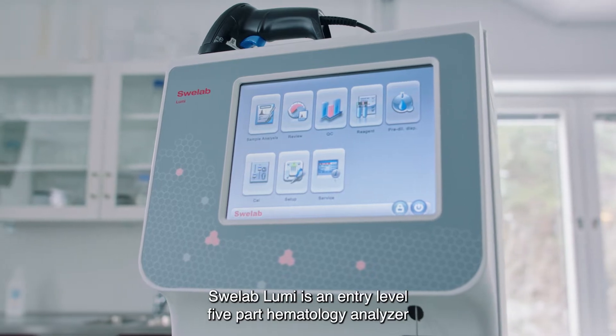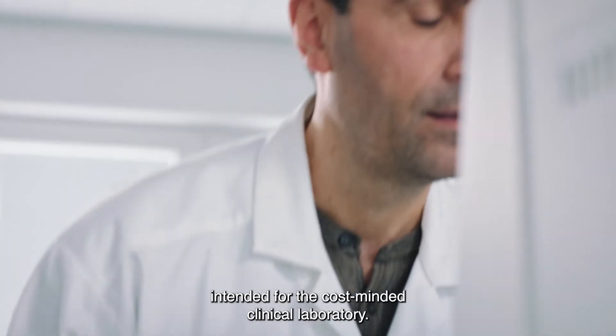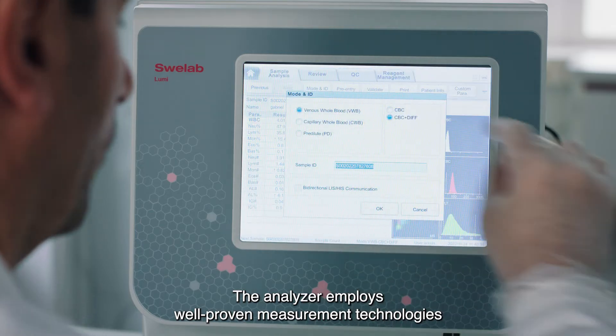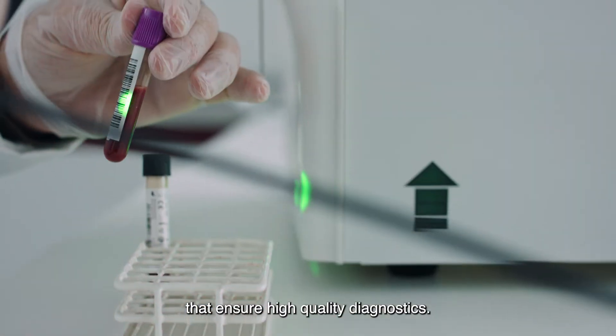SWE Lab Lumi is an entry-level, five-part hematology analyzer intended for the cost-minded clinical laboratory. The analyzer employs well-proven measurement technologies that ensure high-quality diagnostics.